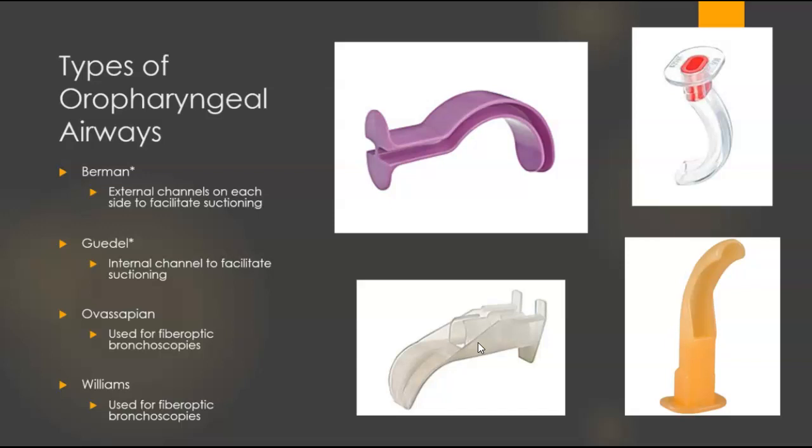They might do washings of the lung tissue with the bronchoscopy equipment to look for sources of infection as well. So these oral airways are helpful with that just because those are very expensive pieces of equipment. And if your patient bites on it even a little bit, you will wreck the fiber optic fibers and you'll be throwing a $10,000 piece of equipment in the trash.